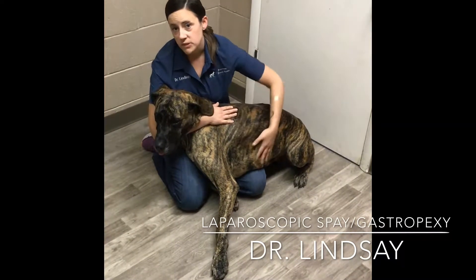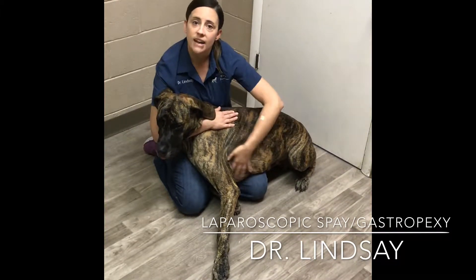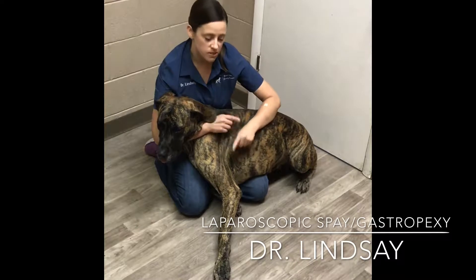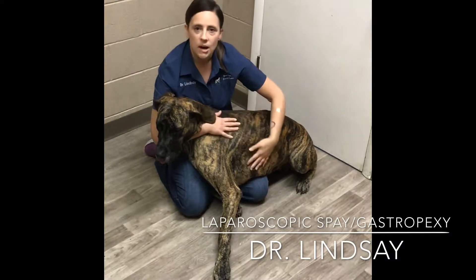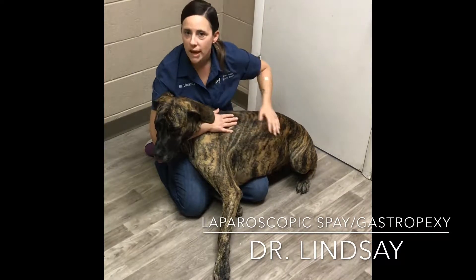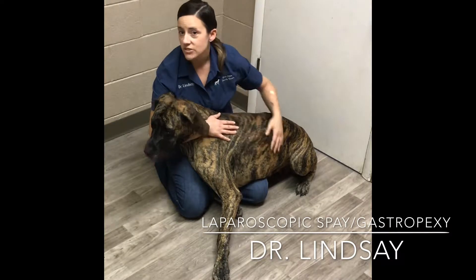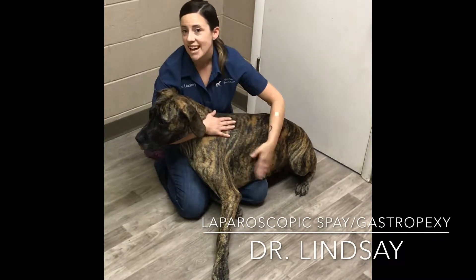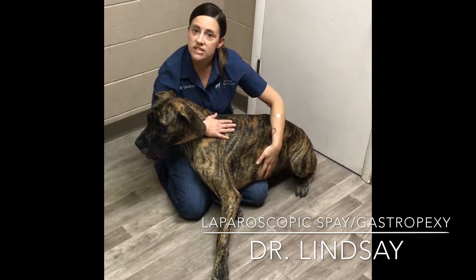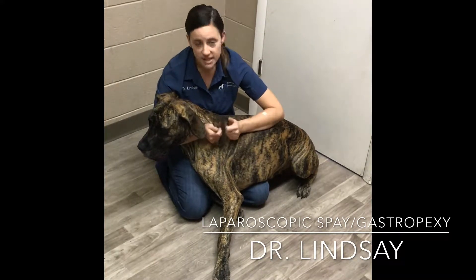We are one of the few hospitals that can perform laparoscopic surgery. Normally her incisions would be about that long, which results in a longer recovery time and more pain for Scout. With our laparoscopic services, we actually do the surgery inside of the patient with cameras, so she'll have several incisions that are about the size of the end of my thumbs.